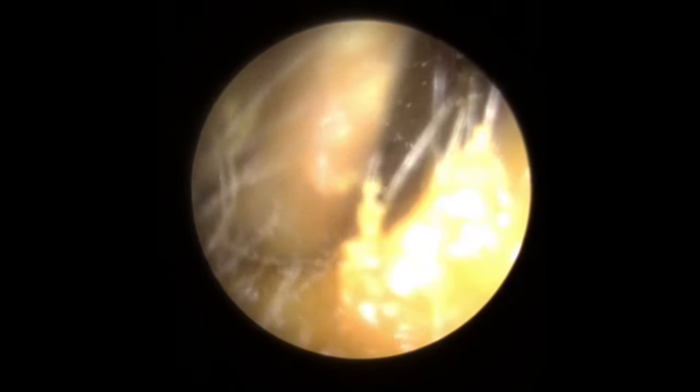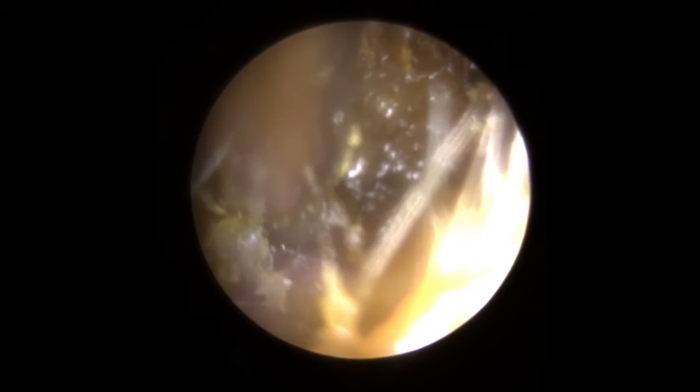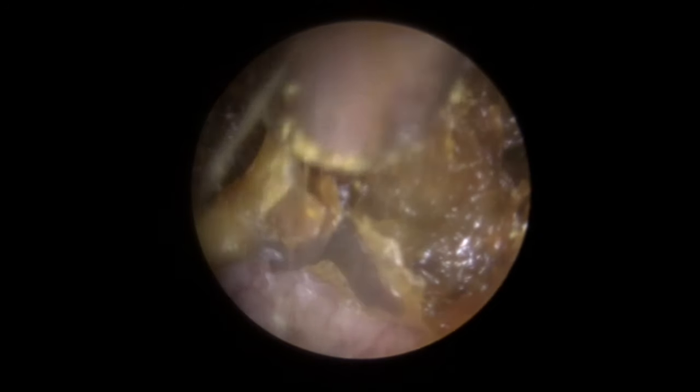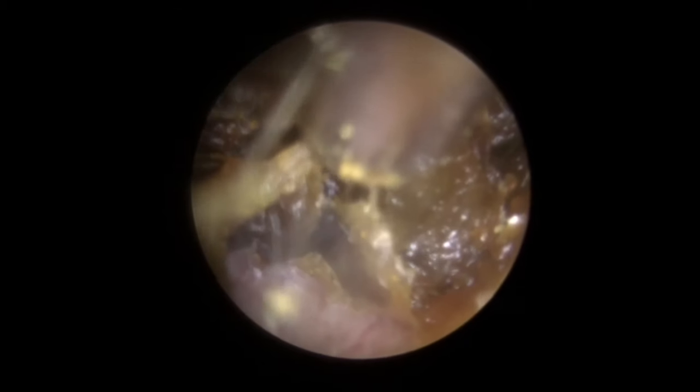So it is starting to peel apart a little bit better. You can see as we're suctioning it in — you can see the little bits of skin getting suctioned in there as well. I'm aiming for the left-hand side — I want to peel away from the left canal wall. So I'm looking for where this wax actually starts. There we go — you can just see we've got a bit of a ridge there. So we're going to work that ridge. There's a little bit of skin to the left-hand side which is probably going to come away with it as well. There we go — all starting to peel away really nicely from that left-hand canal wall.